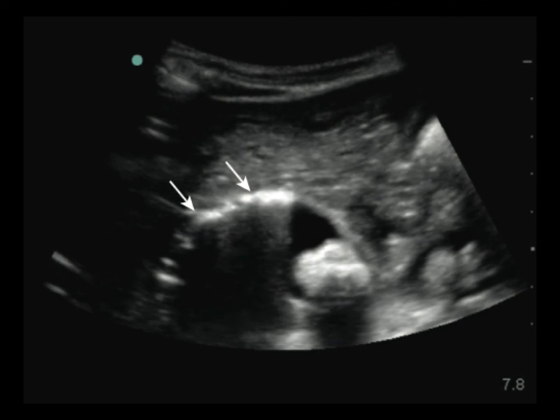So there is a large hyperechoic stone in the gallbladder with posterior shadowing. You can see that on the right side of the gallbladder here. Additionally, there appears to be a hyperechoic anterior wall of the gallbladder with an obscured image posterior to this wall. There is some trace pericholecystic fluid. This is actually a case of emphysematous cholecystitis. There is gas in the anterior wall caused by infection with gas-producing organisms.